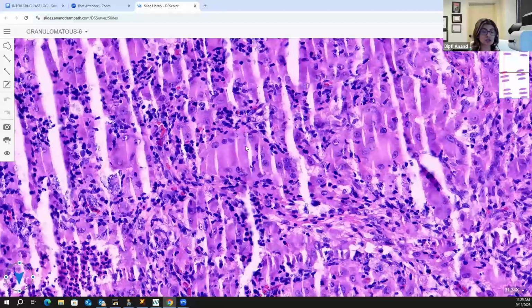That is a true diagnostic challenge which everybody faces. When we come across a xanthogranuloma-like lesion, we always think, is it a xanthogranuloma or reticulohistiocytoma? Most often it is actually a xanthogranuloma, the reason being that xanthogranuloma is the one that goes through the varying stages.